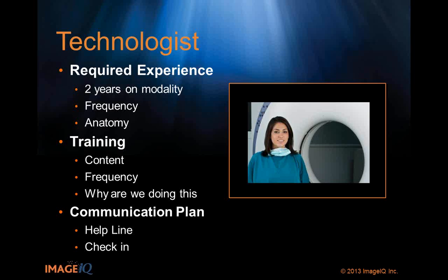As it was getting to mainstream, different sites were phasing it in at different time points. You had to buy special coils, all this kind of stuff. So I know in the centers that I've dealt with, we had some centers that could do breast MR and some that couldn't. Then within the sites that could, we had some techs that we had specially trained to focus with breast MR, with the patients, with their specific needs, to work with them and position them just right so they could tolerate the exam.